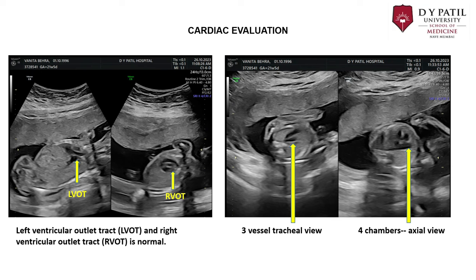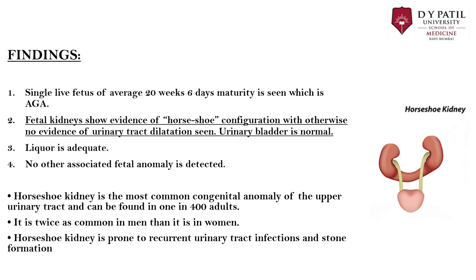Cardiac evaluation shows left ventricular outflow tract and right ventricular outflow tract. The three-vessel tracheal view and axial view show four chambers of the heart, and no cardiac anomaly was present. To summarize, findings included a single live fetus of 20 weeks and 6 days maturity, appropriate for gestational age. Fetal kidneys show evidence of horseshoe configuration with no evidence of urinary tract dilatation. Urinary bladder is normal, liquor is adequate, and no other fetal anomaly was detected.